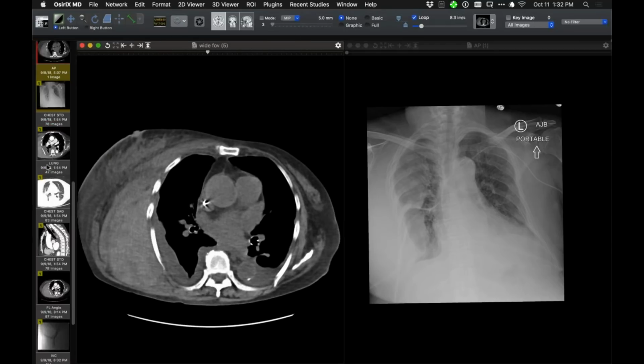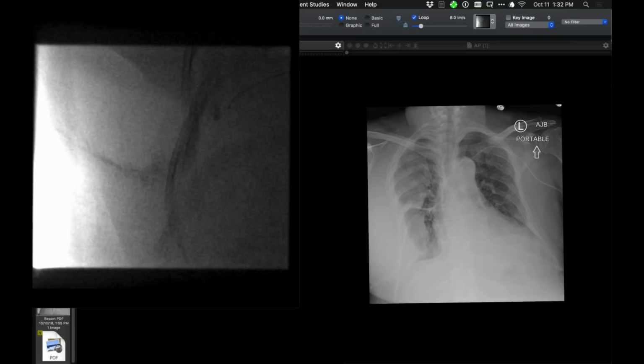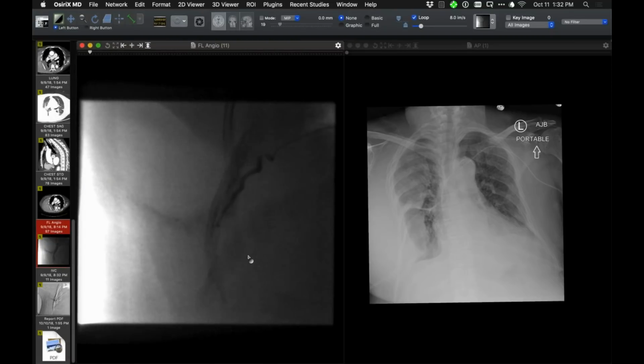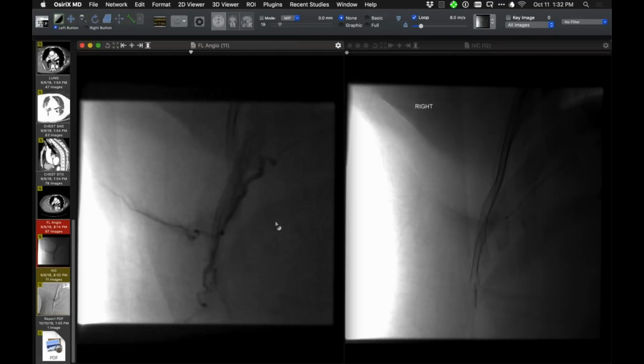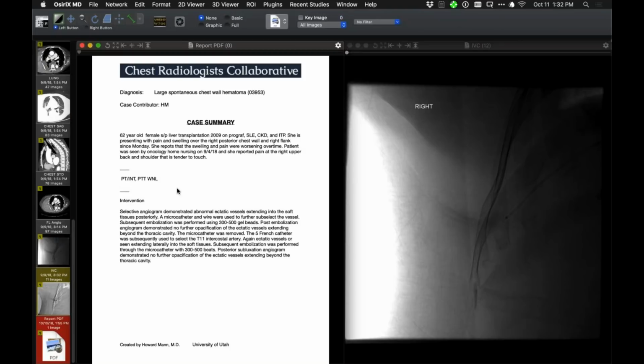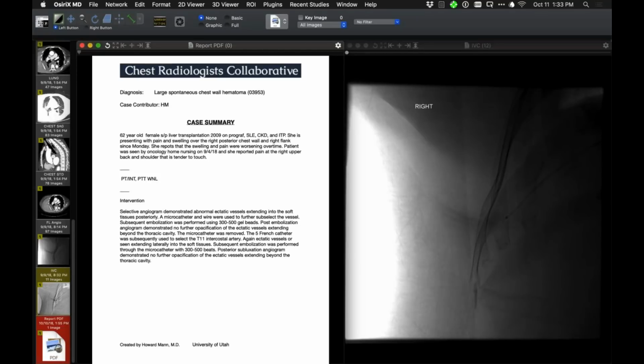This one too just developed without evident trauma. The patient has a history of SLE. They went in and because it was getting bigger, they found some vessels, intercostals, that they embolized. So this is post-embolization on the right-hand side. Here is one of the intercostal vessels that they found and embolized. But the etiology here isn't very clear either. You can see the history here. History of liver transplantation, patient with SLE that suddenly got this chest pain transferred with a huge hematoma. So we had two of them in a short period of time.